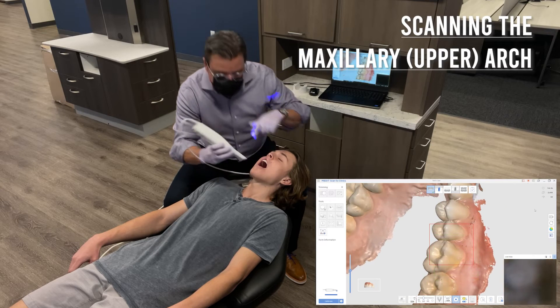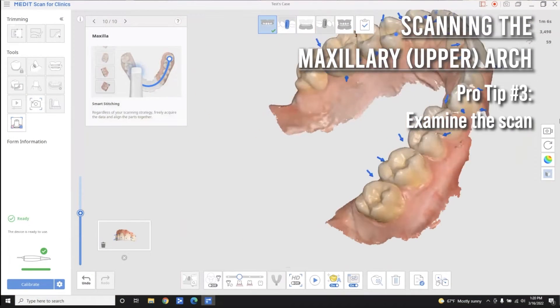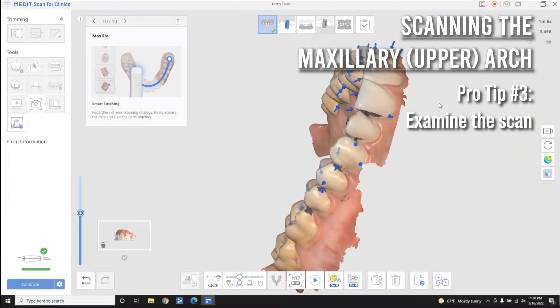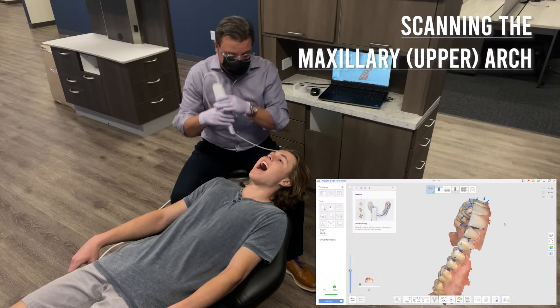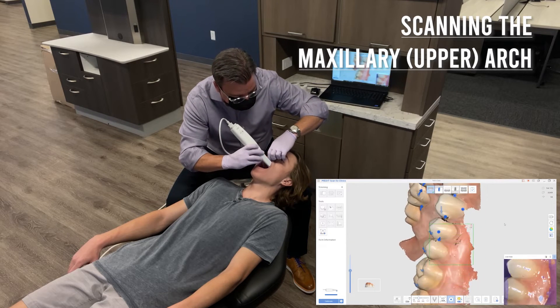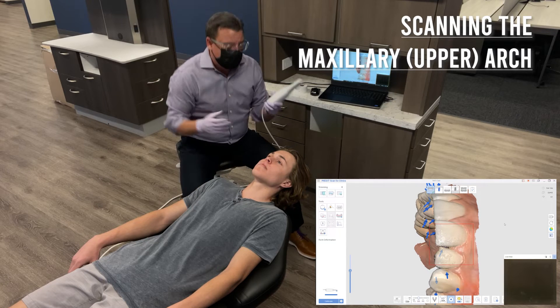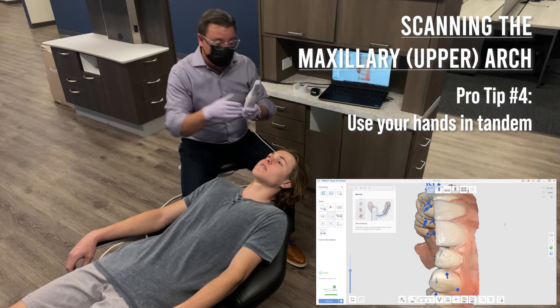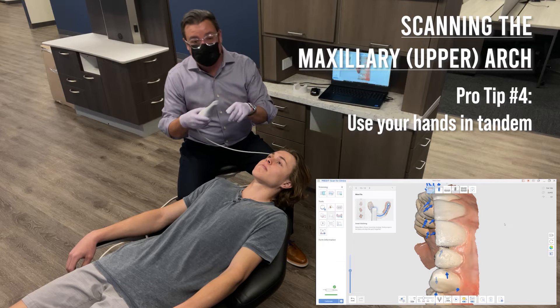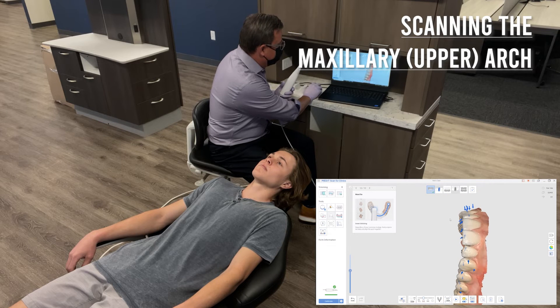Of course you can always go back if you miss something — no one's perfect. Now we'll take a look and examine the scan and see what we got. Right here you can see — as I said I'm not going to miss any tissue — I did miss some right there, so let's go ahead and capture that. All I have to do is turn the scanner back on. You'll notice my hands work together: if my scanner is moving, so is my left hand acting as the retractor, and it also works as a fulcrum as I come around the facial side. Now we have our complete scan and I'm happy with that.